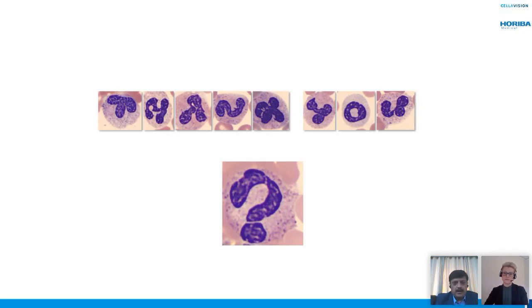I think I can add to that. It's something like what we do for our cell counters: you require a standardized EDTA to blood ratio, and you require a good quality of anticoagulant. Once you have a good quality sample to offer, then the cell counter obviously does its job. I think it's the same here. The pre-analytical step is pretty important even for digital imaging. It's not mandatory to be out of a stainer or a slide maker, but it's very important that there is good quality and consistency in the slide preparation as well as the slide staining.